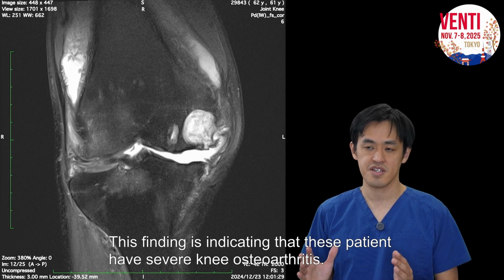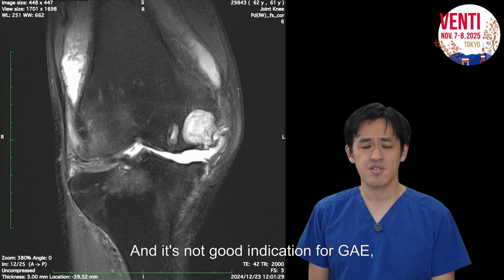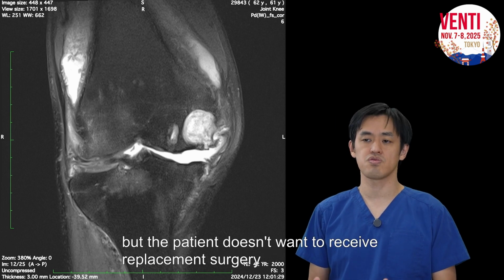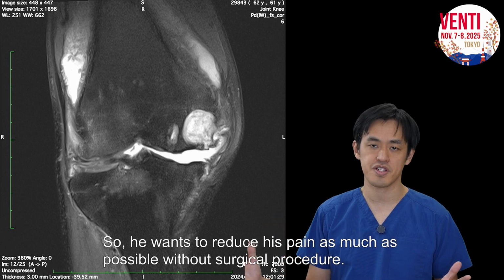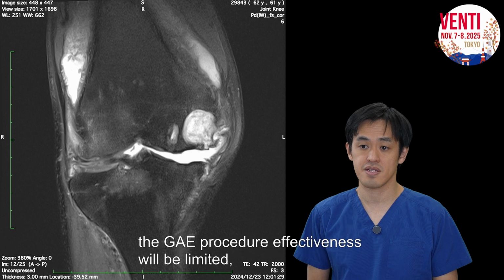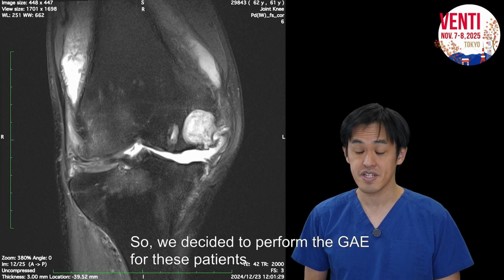This finding indicates that this patient has severe knee osteoarthritis, and it's not a good indication for GAE, but the patient doesn't want to receive replacement surgery, so he wants to reduce his pain as much as possible without a surgical procedure. He understood that the GAE procedure's effectiveness will be limited, but still wanted to receive GAE, so we decided to perform GAE for this patient.